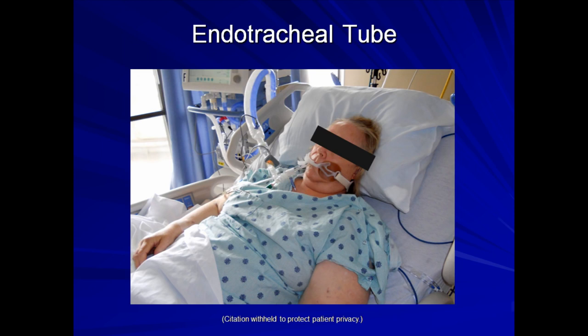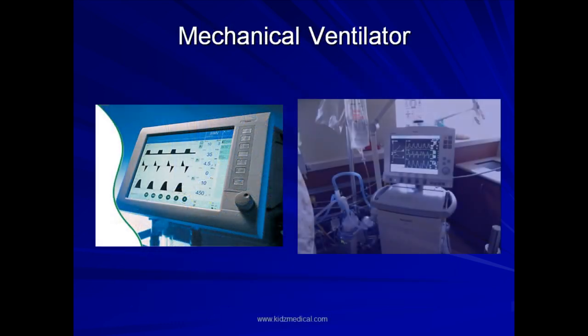In the back and partly cut off is the actual ventilator itself. Modern ventilators are quite sophisticated. Here are two popular models that you will likely see around the ICU.